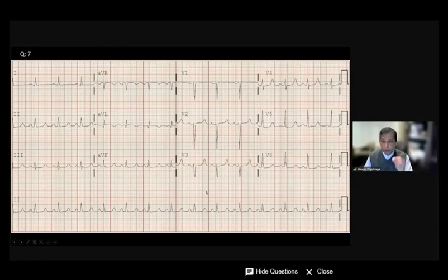Although I told you that this is a patient who came to the office and had the ECG, that was not the case. This patient was having dialysis and had a cardiac arrest. That's how I got involved. I'm looking into cardiac arrest in a 35-year-old with end-stage renal disease. These patients have vascular disease, cardiomyopathy, all kinds of electrolyte problems and all that stuff, and obviously premature coronary artery disease.